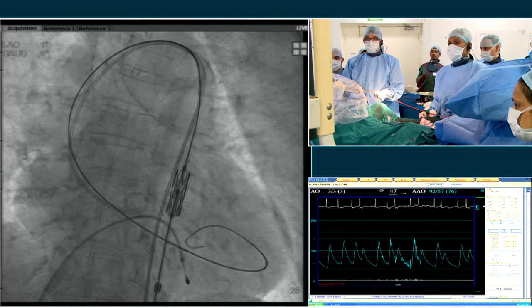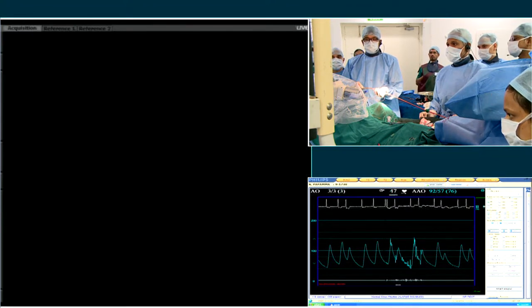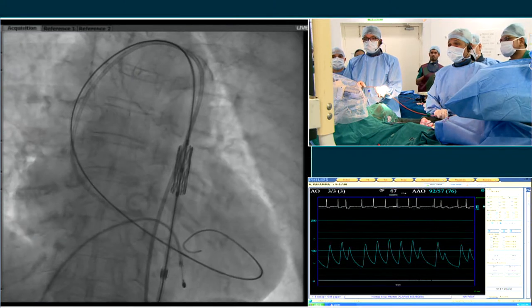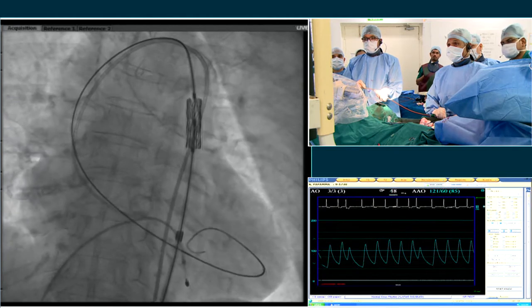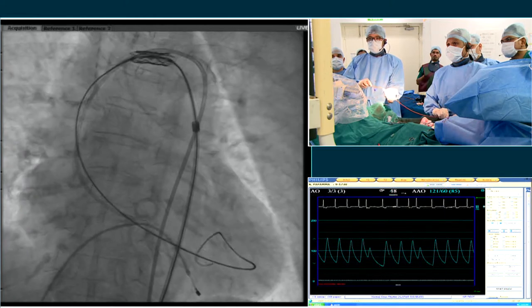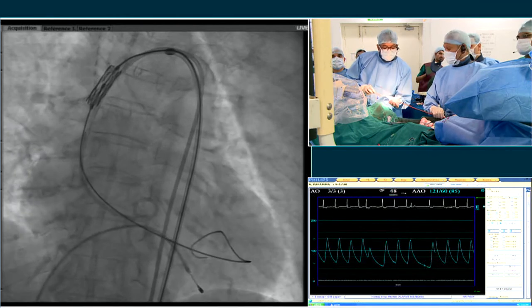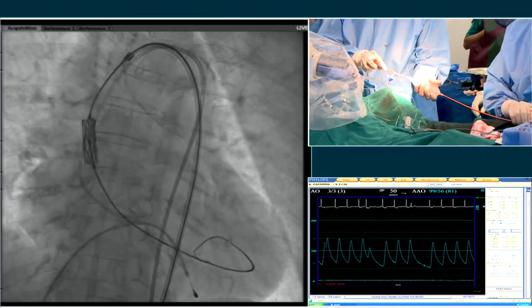Here the goal is we see the calcium, we see the pigtail on the outer curve. Ideally, we don't want to scrape along that. So I'm going to start flexing now, try and come off, and see it's coming off that outer curve. It's a mixture of flex and holding rail on the wire. So I don't want to flex anymore because I'm off. Then I'm going to let him come up, and then I'm going to flex more, and I'm going to pull. Pull wire a little bit more. Oop, I think that's the limit. Okay, so I'm going to pull a little wire.